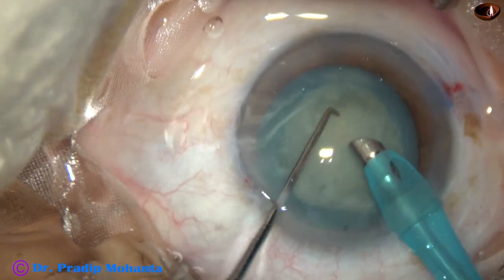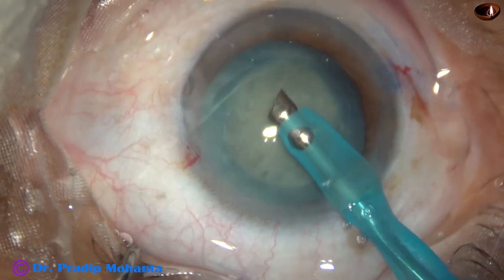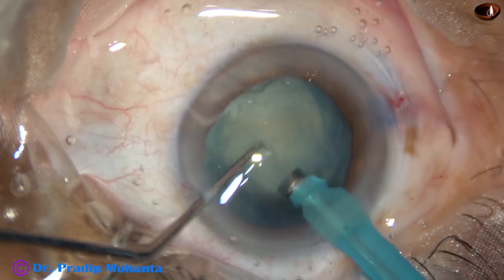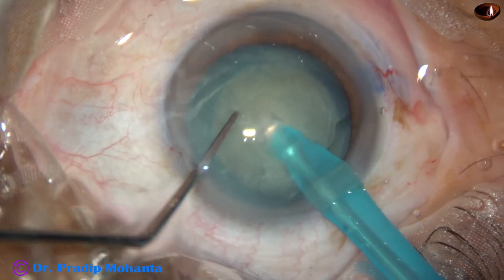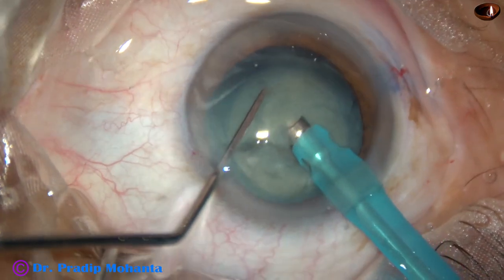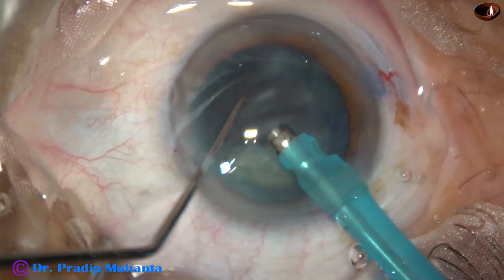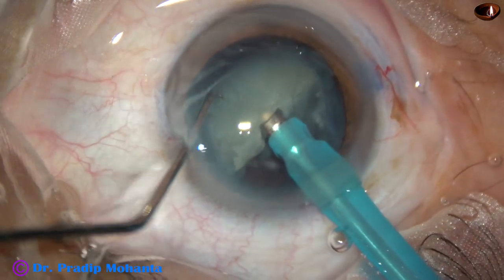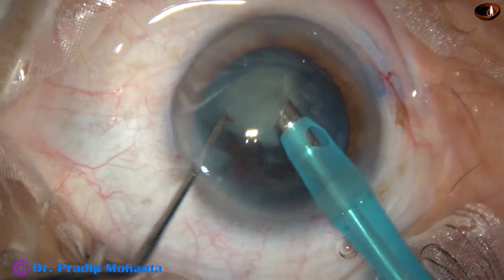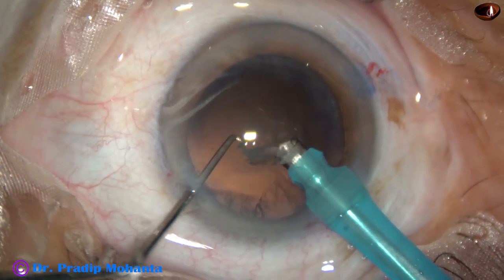The handpiece is turned using the left hand and now the nucleus is to be divided into pieces. The tip is buried into the substance of the nucleus, goes through the nucleus for some distance, and the nucleus is chopped. This technique is known as submarine chop. Each fragment is emulsified and removed. Ultrasonic energy used in this case is 60 percent, flow is 40 ml per minute, and vacuum is 400 mmHg. This is the last nuclear fragment. The anterior chamber is very stable; bottle height is 110 centimeters.